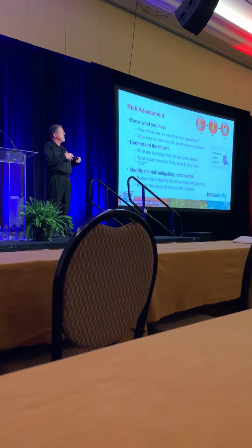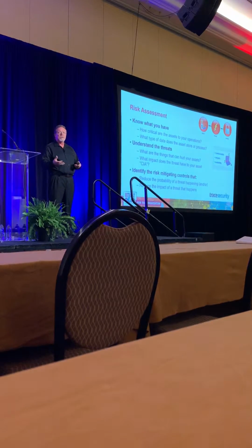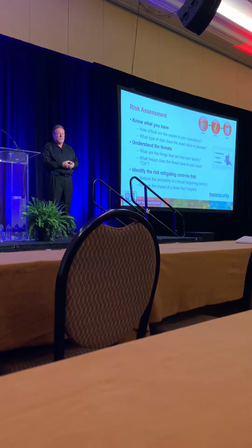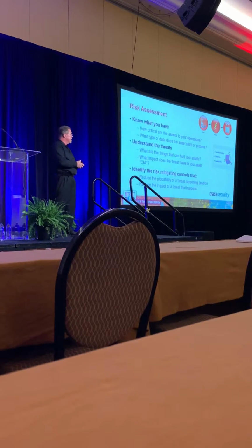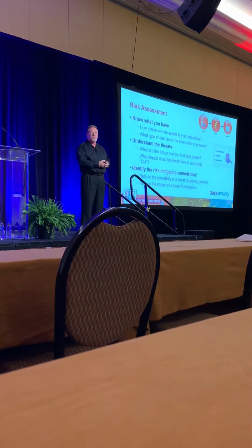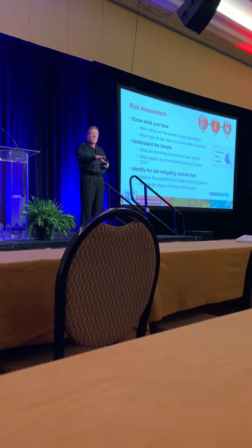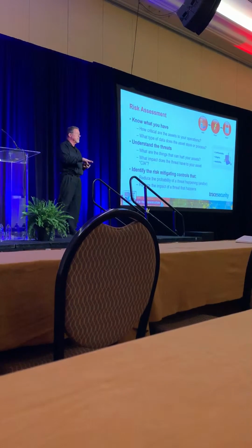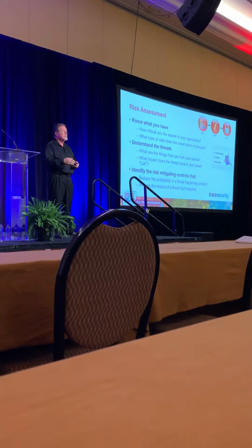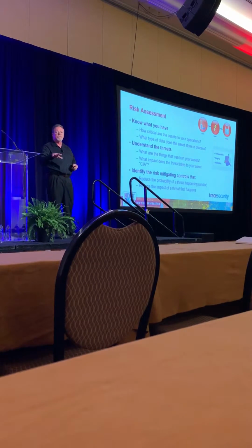But you need to understand that all of the equipment that you use, all of the systems that you use, each have different attributes, and you need to understand how critical they are and the type of data they have. John just mentioned a lot of threats. The threats are real, but you need to understand how the threats could impact your assets, and then you need to know what types of controls you currently have in place in order to reduce the risk of those threats. The end game is that you want to know the residual risk. Why do we do that? Well, part of the reason we do that is so that we know where to apply limited resources.